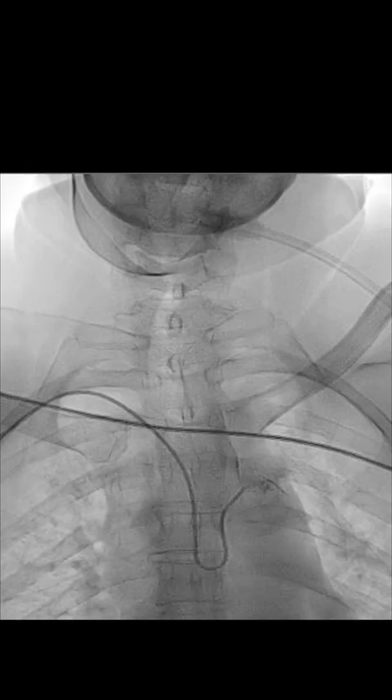When you take an angiogram, you know that there is a kink, and one has to navigate this area very carefully. Otherwise, there is a small chance that you can dissect or injure the vessel. This can be easily converted to a road map, and based on that you can pass your wire easily without any problem. See that once the wire has passed, the vessel has straightened up, it is a clean vessel, the catheter went in easily, there is absolutely no problem.